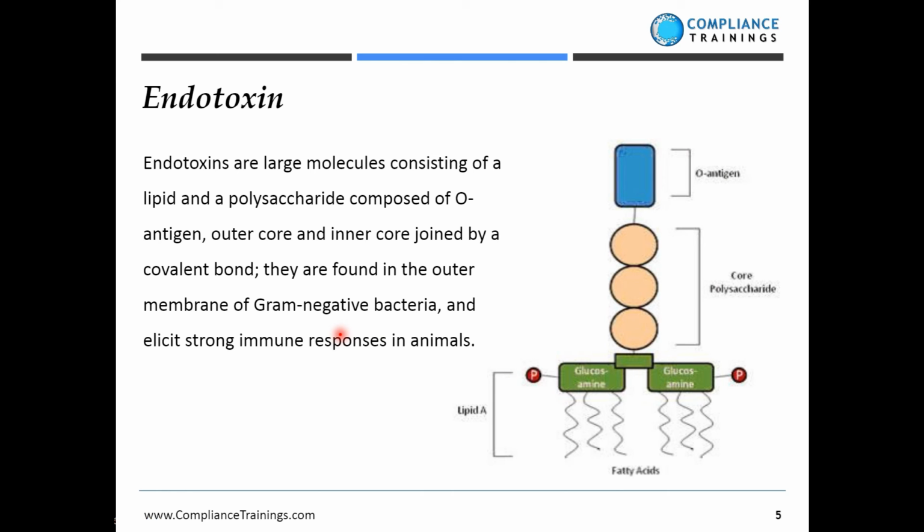Pseudomonas is another gram-negative bacteria that can contain endotoxins. So you'll see that it may develop within your water systems. It's a hydrophilic organism that loves water. It likes to sit in the water systems, create a biofilm, and you may see it in there. So that's why a lot of times they have requirements for testing your WFI, your clean steam, to test for endotoxin.